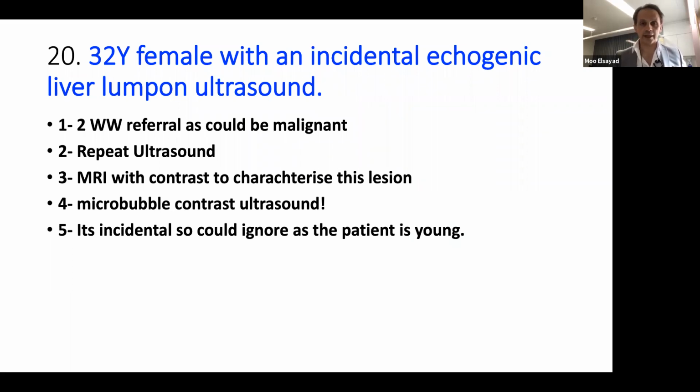32-year-old female with incidental echogenic liver lump on ultrasound. So there's a typing error there. So 30 years old, so young female, had an ultrasound for abdominal pain.